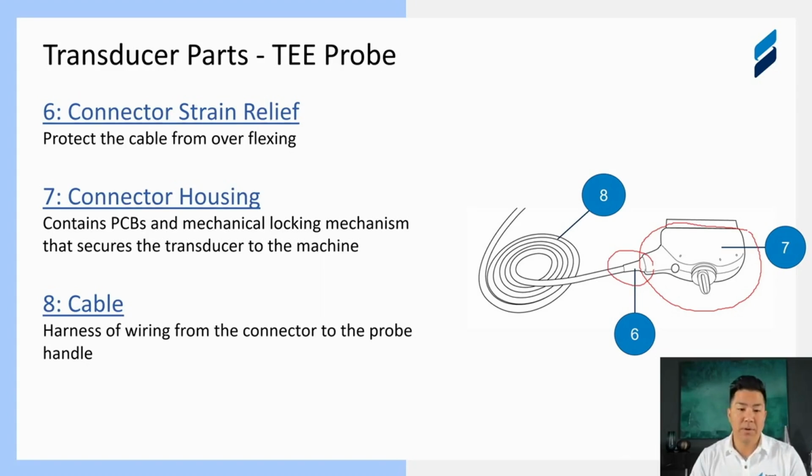And then the cable. So the cable here is simply the cable that goes from, really in this particular case, the handle of the T-probe down to the connector that also houses all of these circuits, and that go from the connector all up to the crystal and back.